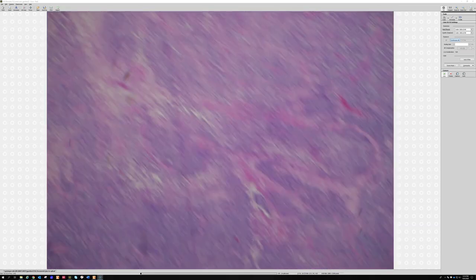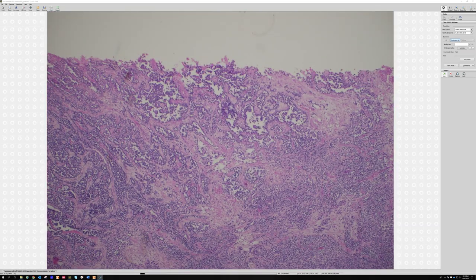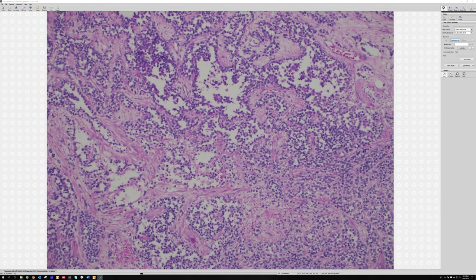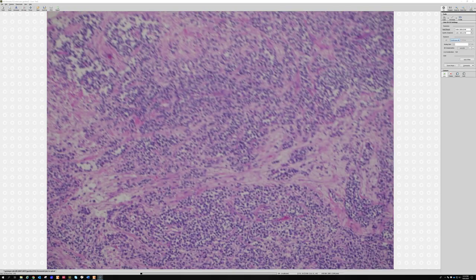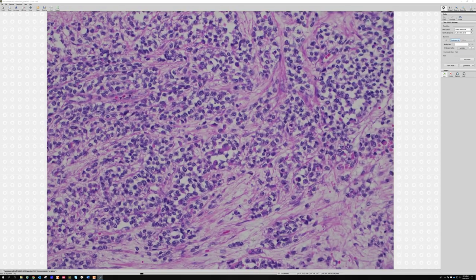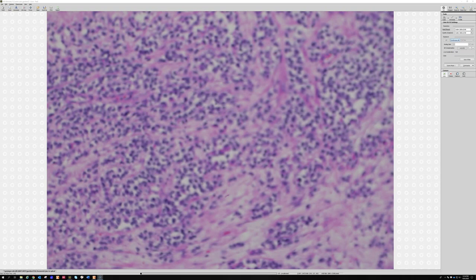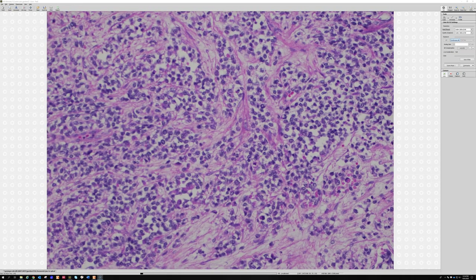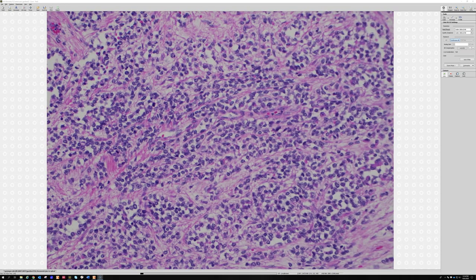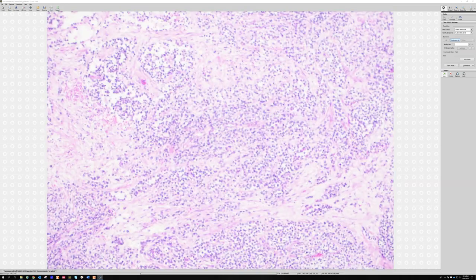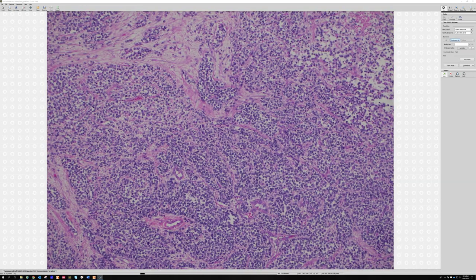There's necrosis in the middle of the tumor, and here are some more pseudo-alveolar spaces. A few cells here have prominent eosinophilic cytoplasm — you can sometimes find plump rhabdomyoblasts or strap-cell type rhabdomyoblasts in alveolar rhabdomyosarcoma. But the best way to learn it is that it is a small round blue cell tumor that makes alveolar spaces with variable amounts of eosinophilic cells scattered within it. I don't see these very often as they're often handled by pediatric pathologists.